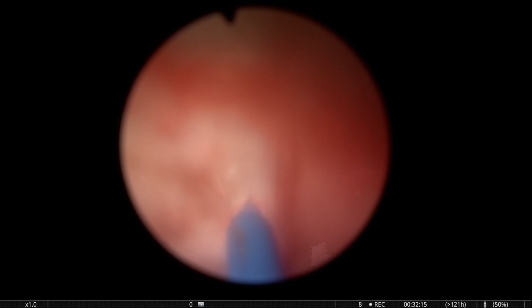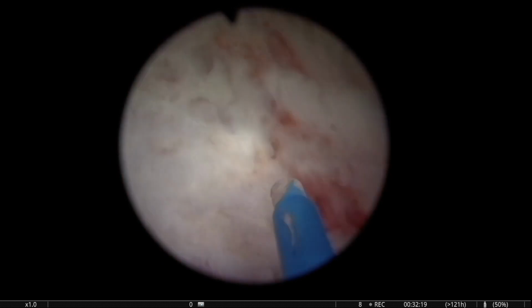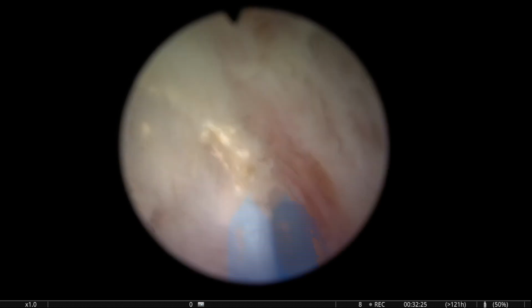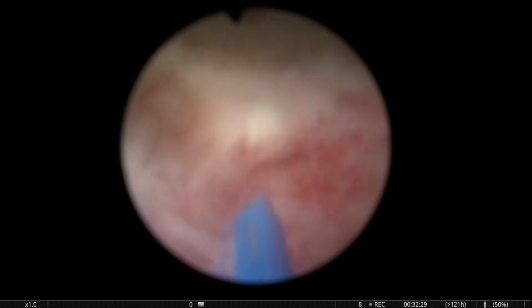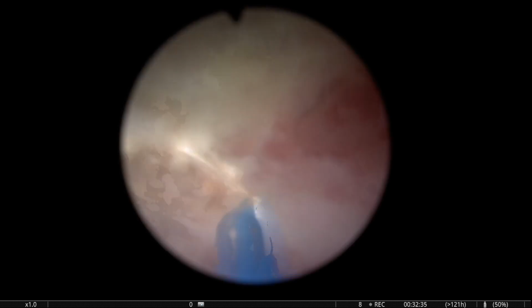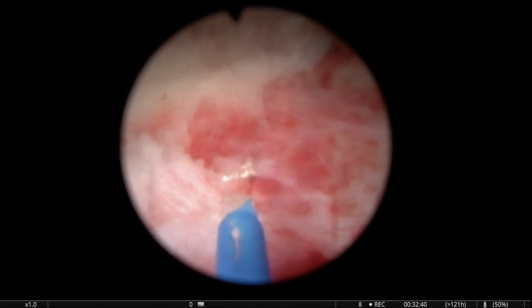You see big veins, probably the patient is absorbing some saline into the bloodstream, and that's a situation that is better avoided. And if it happens, it is going to complicate the morcellation phase as well, because if the pressure in the bladder falls, when you have a venous sinus open, the visibility is going to be compromised.